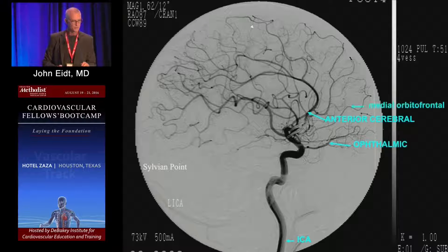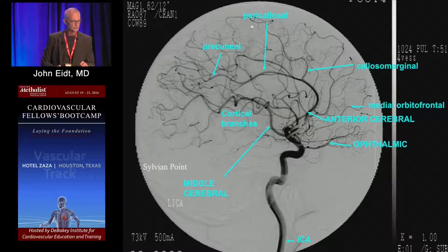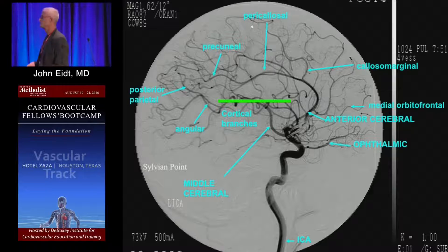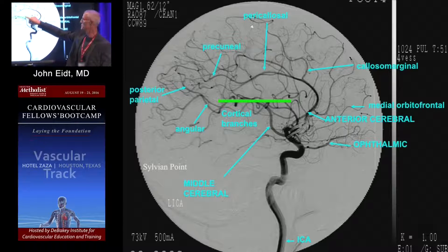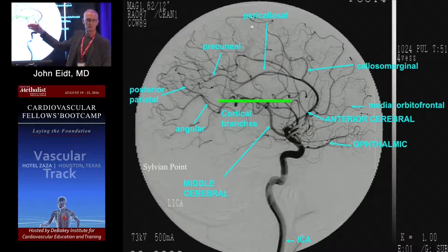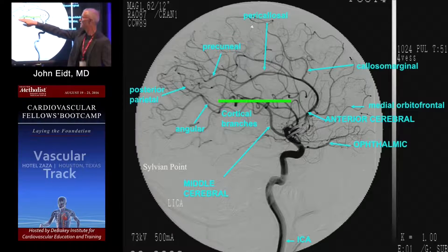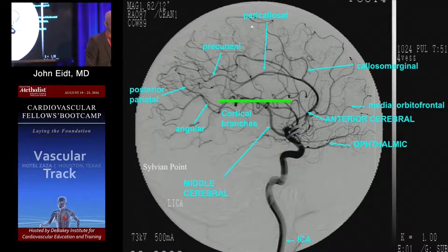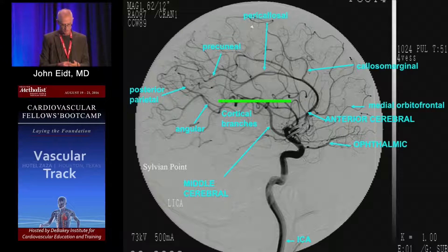Ophthalmic, anterior cerebral — if you're going to be in neurointervention, you'll learn those names. If you have tumors in the temporal lobe, there's supposed to be a series of little hairpin turns as the middle cerebral folds out through the gyrus. It should look like a straight line. If this is deformed, it means you have some kind of space-occupying lesion. Those little hairpins along the middle cerebral are an important picture.